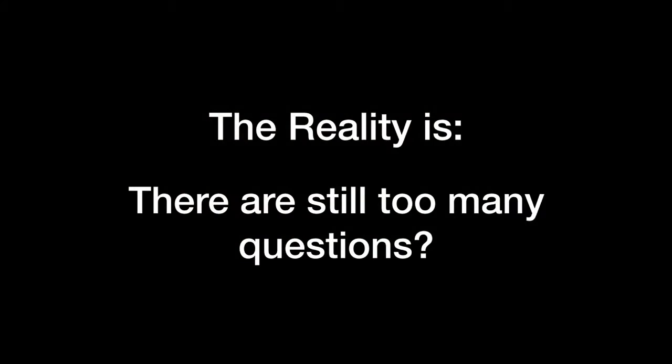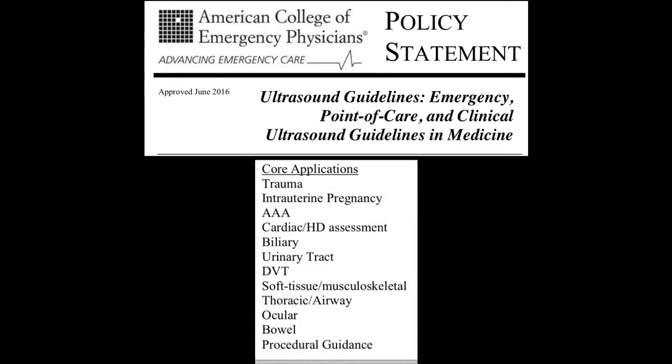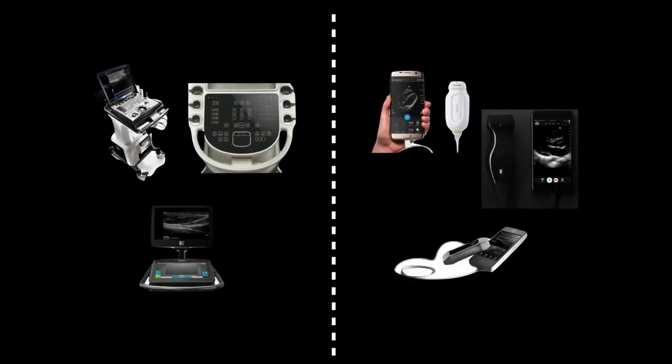So the reality, after we have said all this, Tricker, and answering your question, is that there are still too many questions. Can we say that this is going to replace a cart system? Well, maybe in 40 or 50 years, maybe you are right. There might be a way that the image quality is going to be so much better that you can actually say that. But right now, while we have all these applications, we don't know if these point-of-care ultrasound systems or handheld systems can actually do all of this. Okay? That being said, we still cannot say that we're going to just ditch the ultrasound system. So probably having those two together might be better, basically joining hands to make sure this is what we do better for the patients.